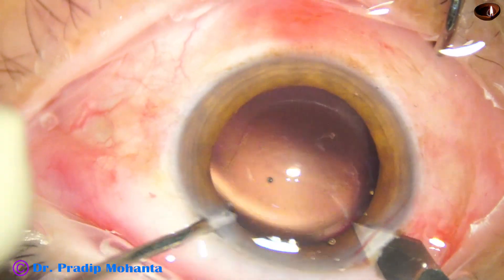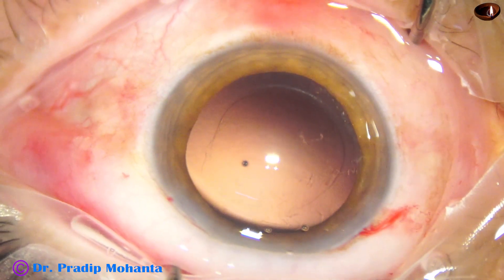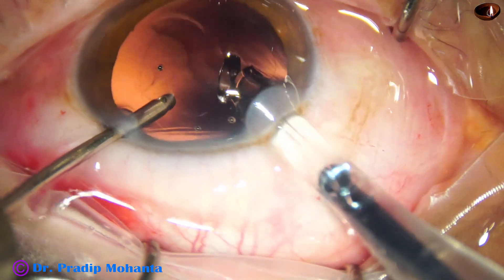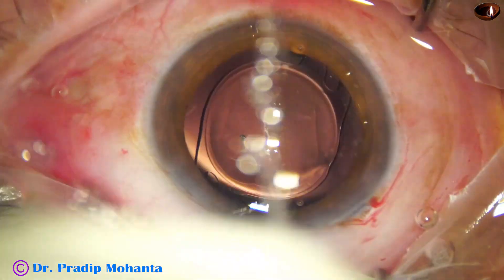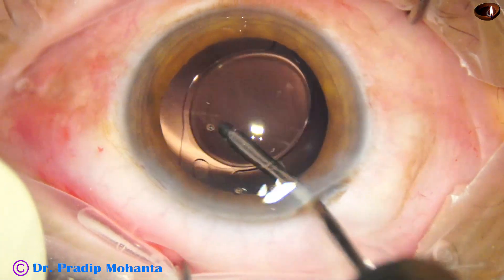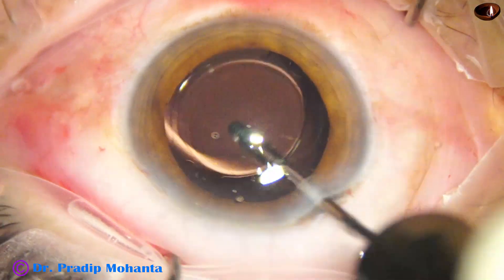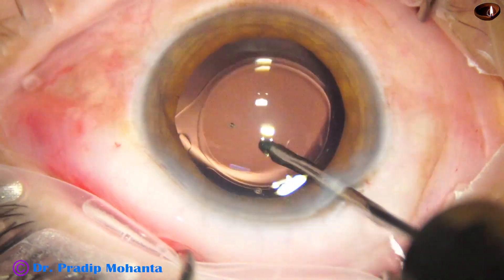The main wound is being enlarged to about 3.1 millimeter because I am using a B cartridge, a wide-bore cartridge. If we do not enlarge the main wound, usually the lens gets stuck at the main wound. If we use a C cartridge or D cartridge, the main wound need not be enlarged, but the optic gets compressed too much and sometimes the lens cracks. You go behind the lens and polish the posterior capsule by the irrigating cannula and see how beautiful the cleaning happens.